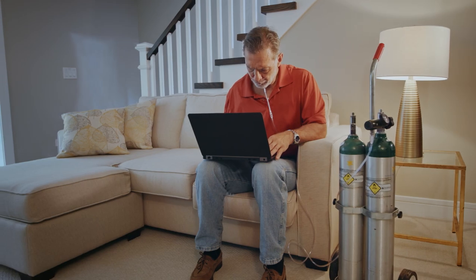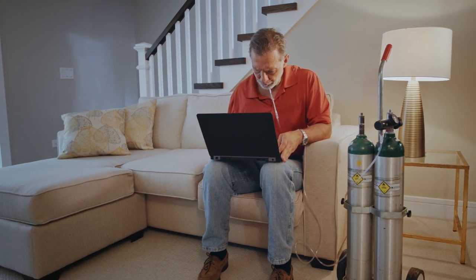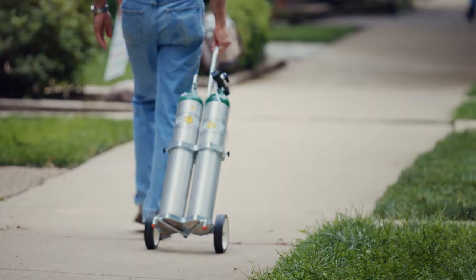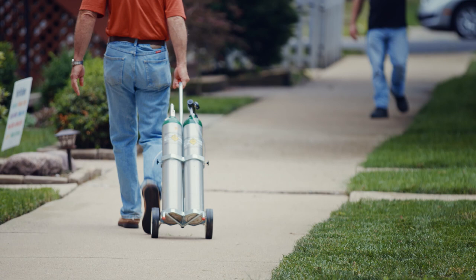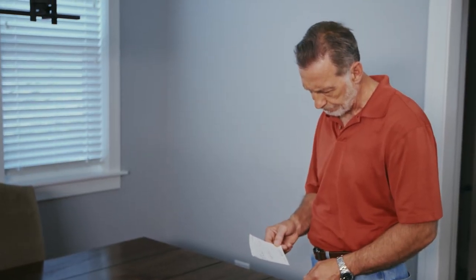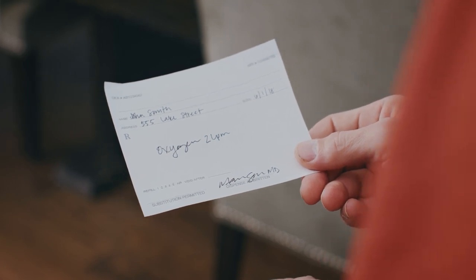Oxygen cylinders are metal tanks that store compressed oxygen. You can use these tanks at home or on the go. The tanks come in a variety of sizes. The smaller the tank, the less oxygen it holds. Your healthcare provider will recommend the right size tank for you, based on how much extra oxygen your body needs.